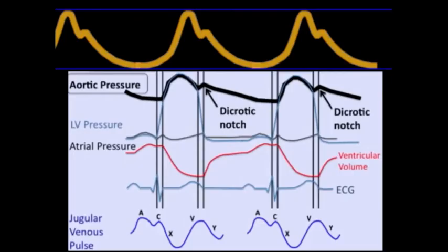So this diagram shows us the entire cardiac cycle and where the aortic pressure curve fits in relation to everything else. So everything goes back to the diagram here that we've all seen before at one point or another. And I strongly recommend that each of us draw this from scratch and make sure that we know we can. And I bet most of us would encounter some difficulty in trying to do so. And that's why I highly recommend it.